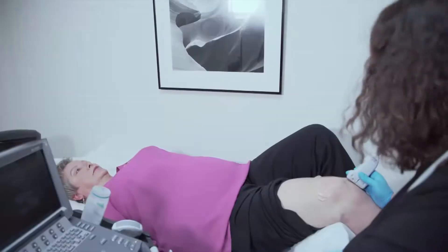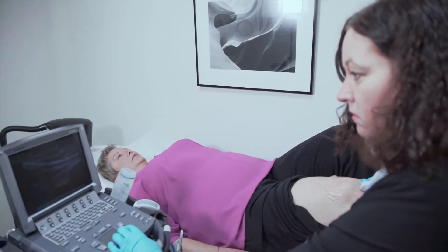In the early stages of rheumatoid arthritis, joints are stiff and painful, but there's no visible swelling to help doctors make a diagnosis. Fortunately, Dr. Chrisoula-Papa says there's a new test that can help.